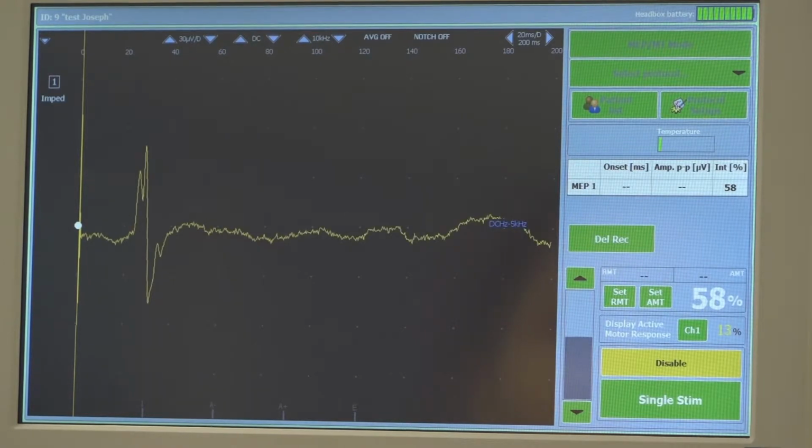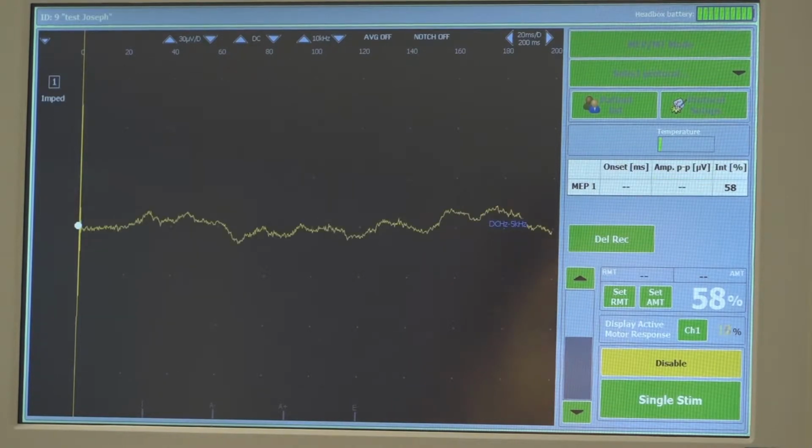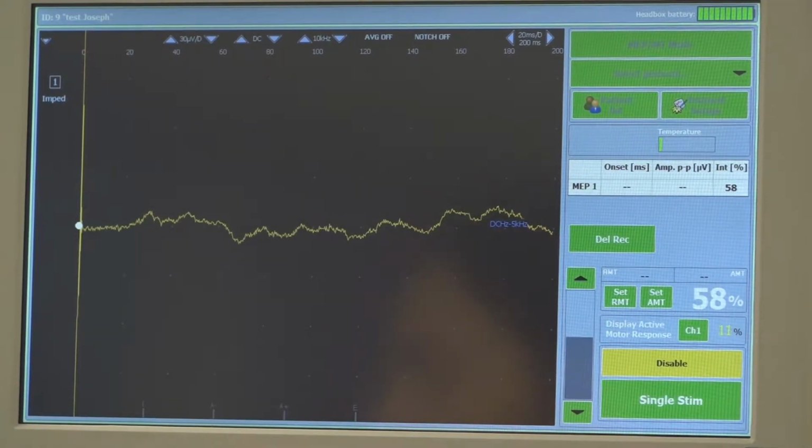Okay, here we have 1, 2. I wouldn't speak normally in a normal session, because when someone is in front or noise is happening, it alters the excitability and I get peaks. So in a quiet environment, with no people around, I'm not talking, counting 1, 2, 3, 4, 5. You check and say okay, 1, 2 in your mind. So let's see.